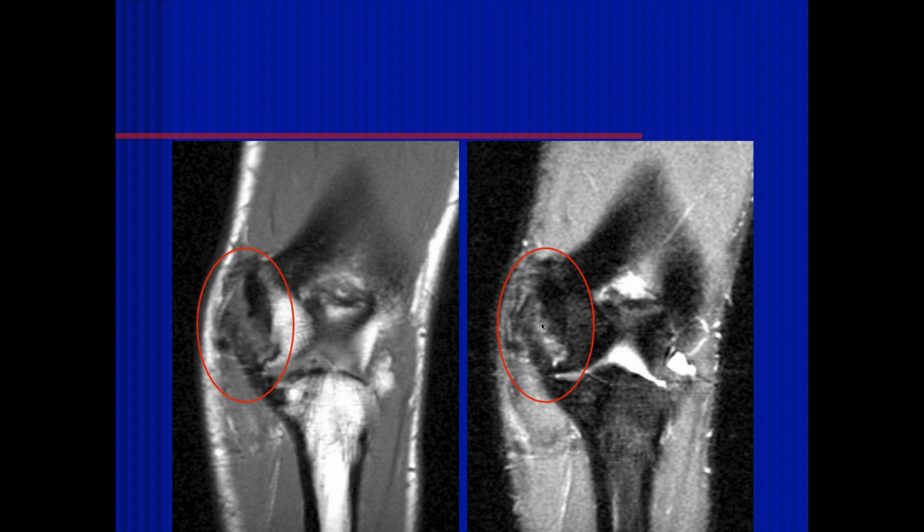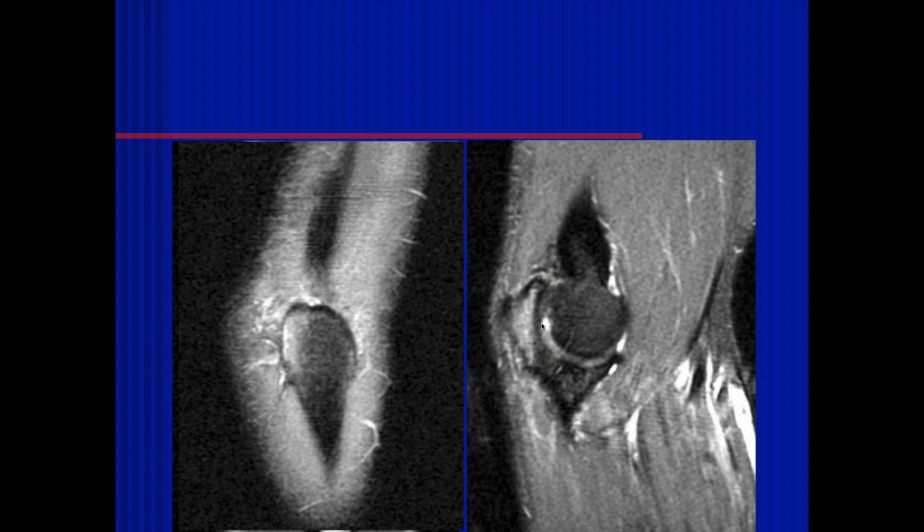And there may be a little excess valgus in this elbow, John. What do you think? Oh, there's kind of a suspicion of a little more extra valgus, maybe, but I can't really tell just on these images. Well, I can't either, but it just seems like there is. Yeah. And this is chronic. This has been there for quite a while. But don't you think? Yes. Except for this area right here.